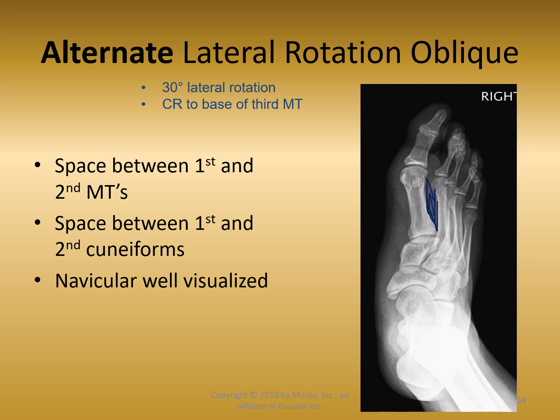And we'll be seeing these structures on the medial side of the foot. We'll see separation between the first and second cuneiforms. We'll see that navicular, nice and pretty. All right, but then we superimpose metatarsals 2, 3, 4, and 5. So the whole reason for this is to see the navicular, the first cuneiform free of superimposition, and the space between the first and the second metatarsals.